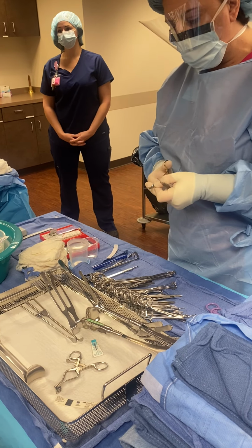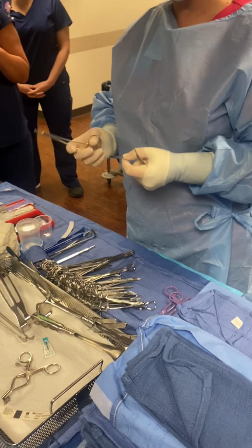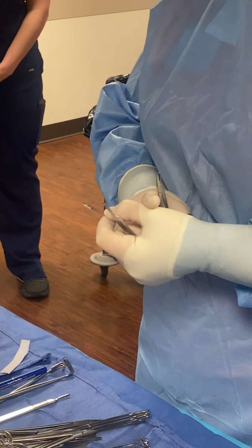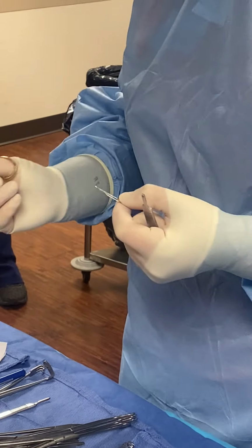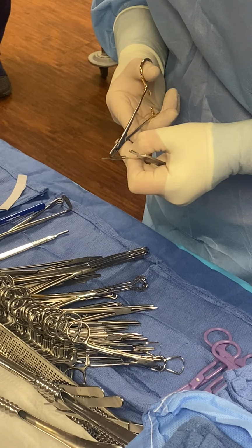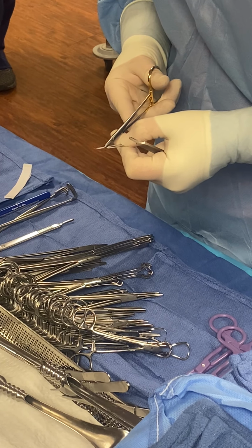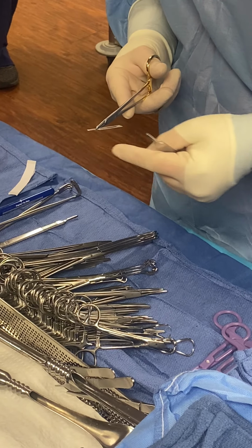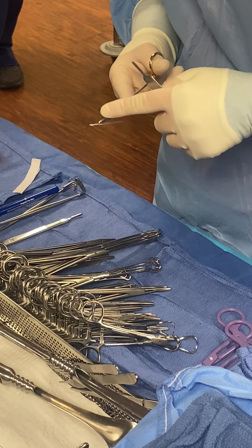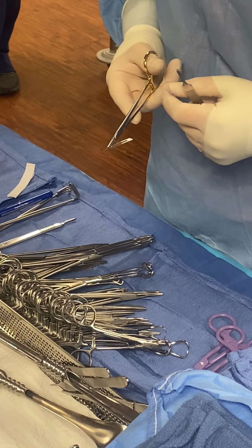When you load the blade, you want to have the needle holder in your right hand and the handle in your left. This is the only way that it really works. Switching hands doesn't really work. You want to grasp the blade on the non-cutting edge. My cutting edge is over here, so I'm on the back of the cutting edge and I'm above this little keyhole. We call that a keyhole.